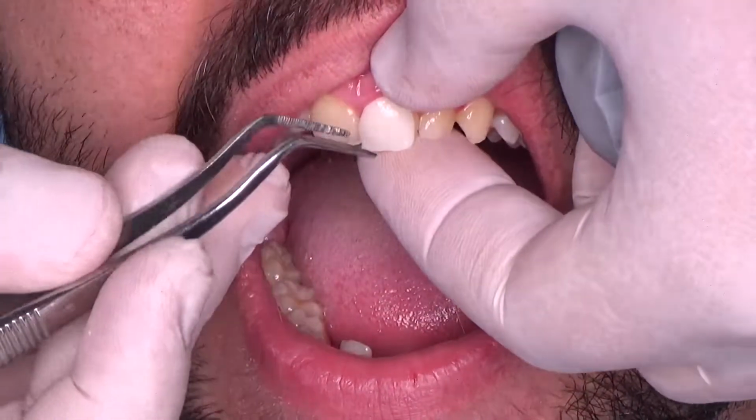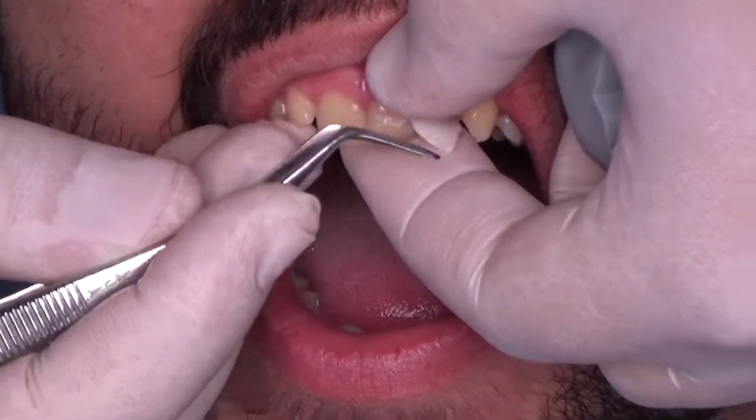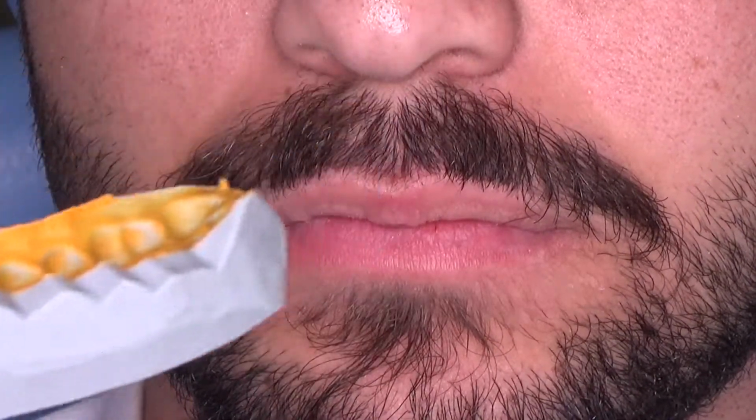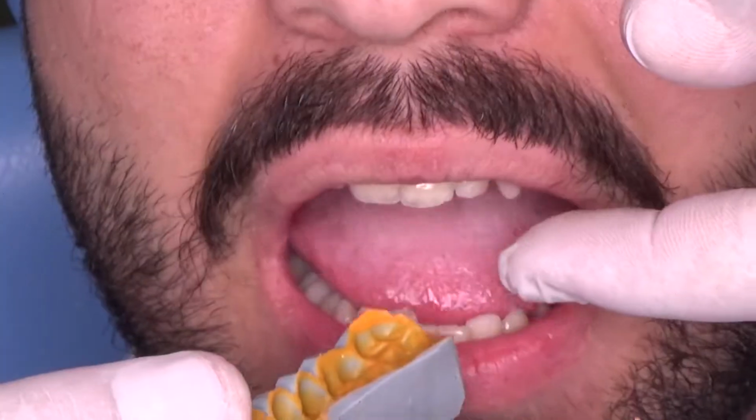This silicone model will fit well because the software made the final mock-up regarding this one, so it will fit with the composite in the mouth. Yes, it will fit with the composite because this is the thickness that we ordered. That's why you did the try-in with this mock-up in the mouth and then you remove it. Yes, I should remove it, and after that I will fill all this with the bisacrylic composite.